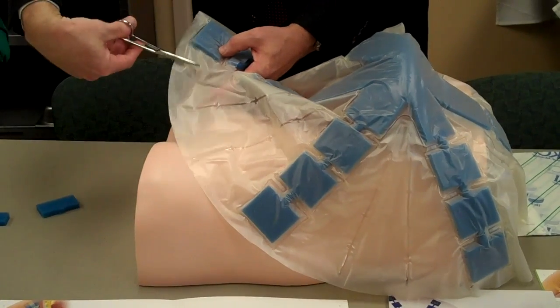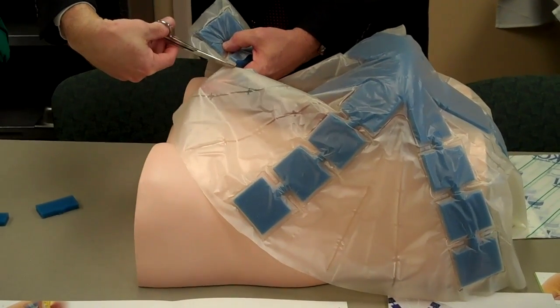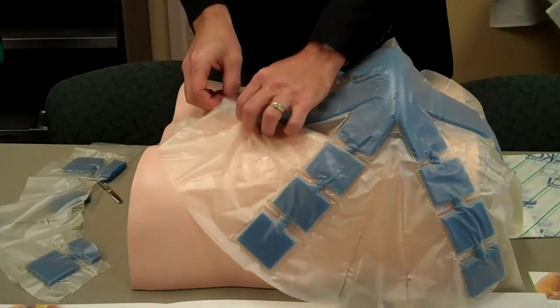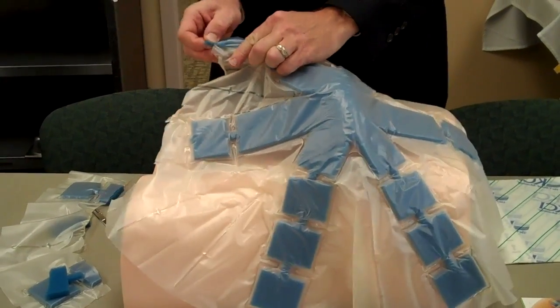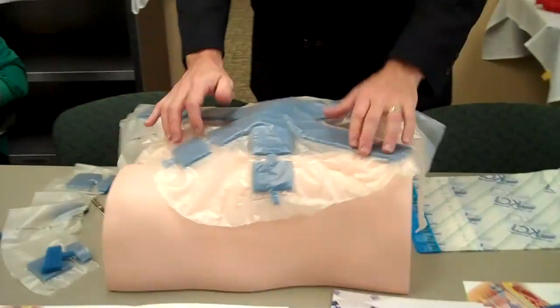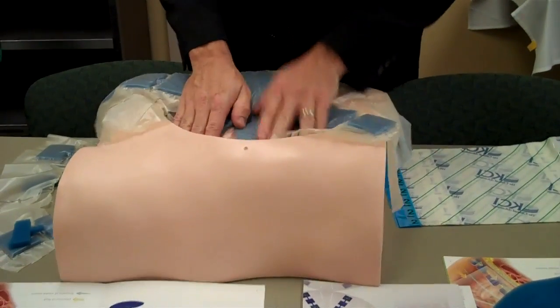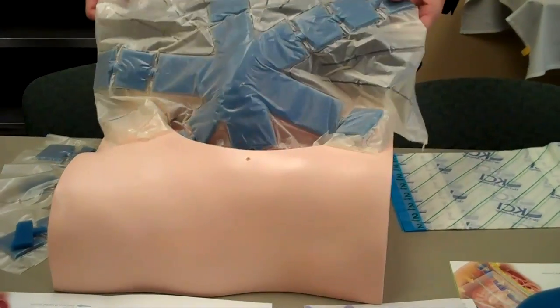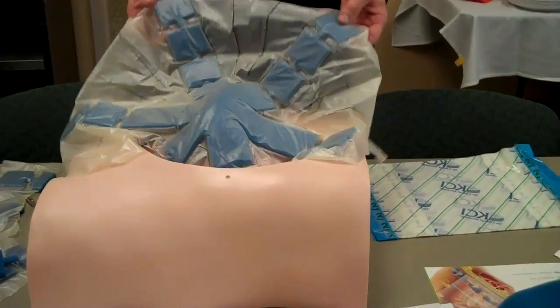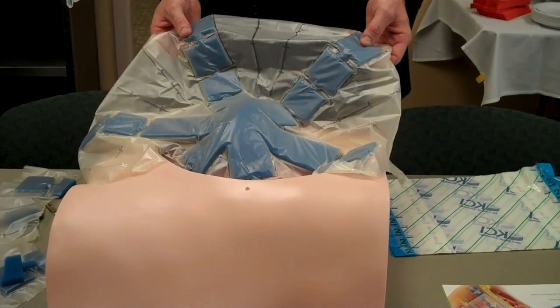Just like that. After you're done going all the way around, you're pulling each of these pieces out. Once you've got it sized to your patient, you're going to tuck this down into the pericolic gutters. The claim to fame of this is that you're going to get fluid egress through these arms of granule foam.